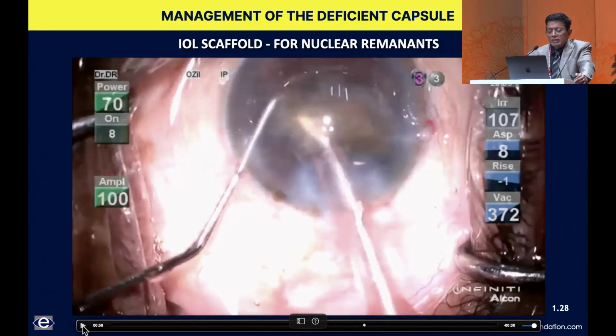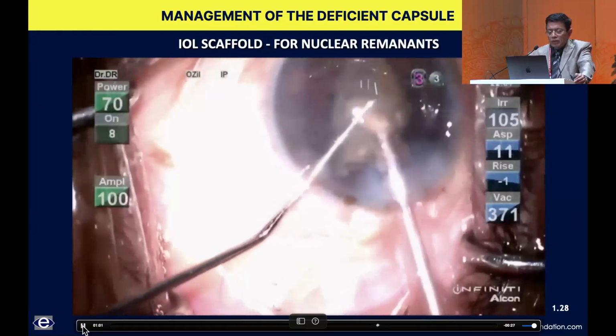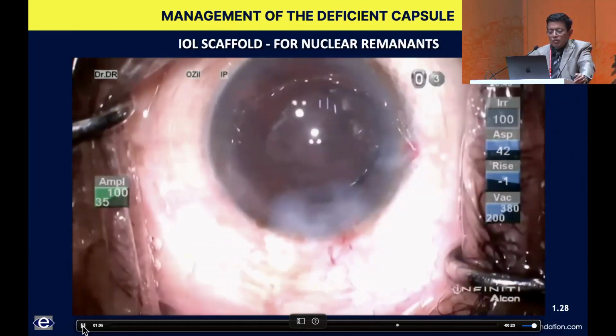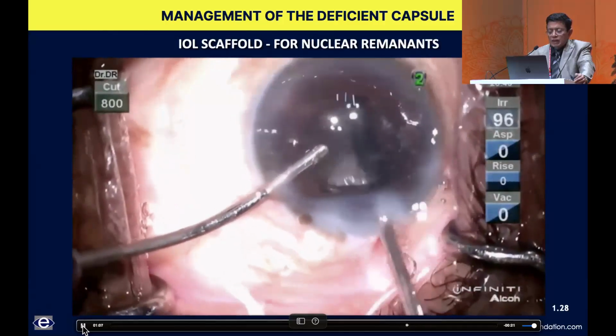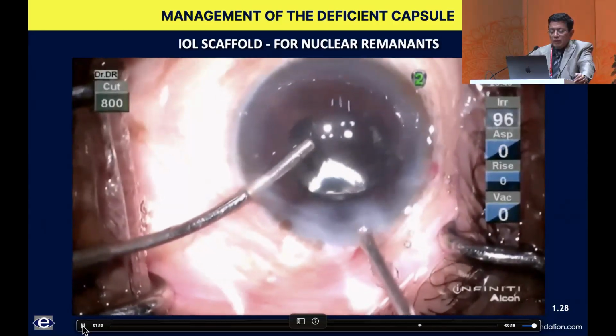Even though it's anterior chamber phacoemulsification, it's an edited video, I use adequate amounts of dispersive viscoelastic to protect the cornea. Go ahead with the subsequent, as you can see, the nucleus comes out very fast. And now, obviously, with a bimanual method, I go in with the irrigation cannula, and through the main port, normally you go through the side port for the vitrectomy, with the vitrector going through that. But in this case, because I have to go sub-incisionally, I'm going through the main port, behind the lens which is there, and then going ahead and removing the vitreous.